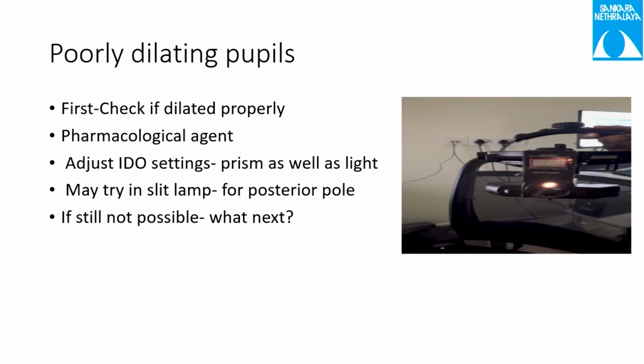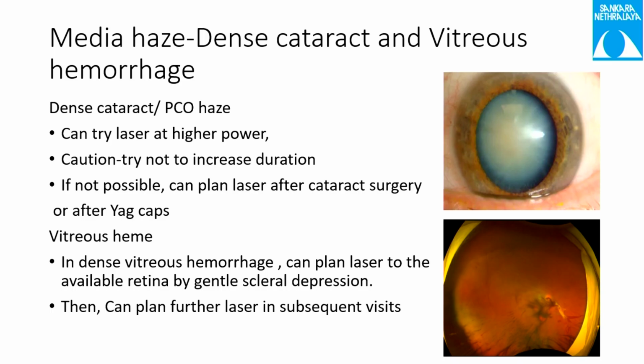If still not possible, then one may consider taking up the patient for cryotherapy. Especially in peripheral lesions, if you are not able to connect the laser to the ora, you can go for cryotherapy under local anesthesia. Now, moving on to the media haze.